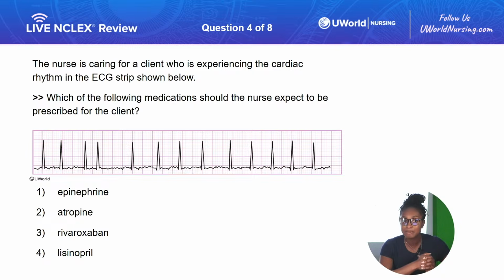Are we using epinephrine? Are we using atropine? Are we using rivaroxaban? Or are we using lisinopril with this client? Let me know in the chat. What type of medication would a client with this rhythm usually be prescribed? Pretty good.